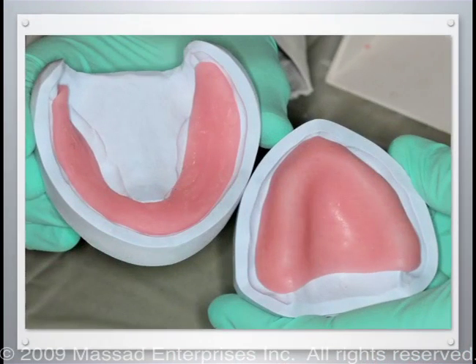This is a close-up of the resin bases. Note, it is important when fabricating these bases that they are fabricated slightly short of the vestibular extension. This is done so that the practitioner can be assured there will be no impingement on any frenum or vestibular attachments while taking the recording. It is necessary for these bases to seat without resistance around any of the peripheral borders.